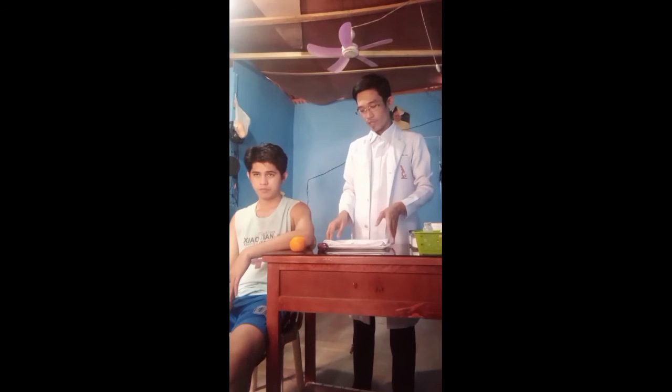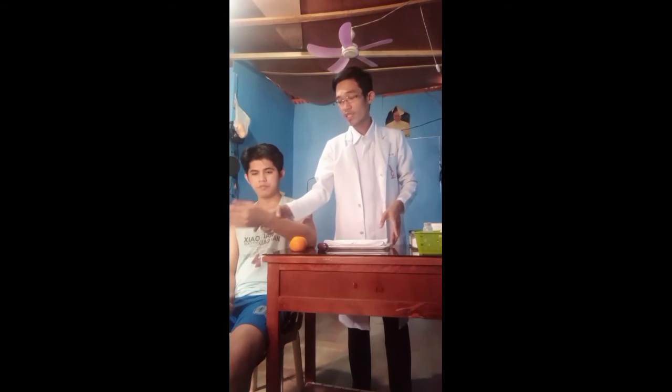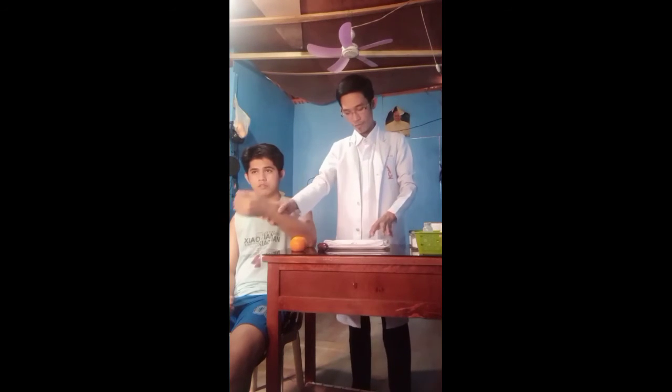So next is ask the patient his or her name, identify patient using a name tag, compare with information on patient's medicine ticket. So the name tag is commonly here in the hands, in the palm. Okay. To ensure that we have a correct patient.